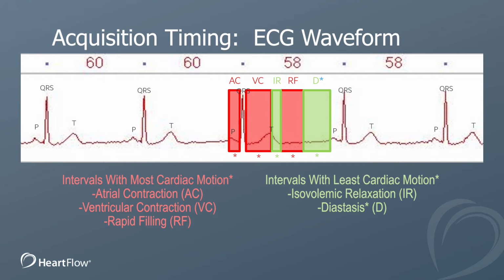If you have a lower temporal resolution scanner, you can see why you need to have a lower heart rate and use beta blocker, based on the width of the rectangle on the right can vary with heart rate. The lower the heart rate is, the wider the green rectangle representing diastasis becomes, and the more opportunity you have to capture a motion-free image of the coronary arteries. So when you give a beta blocker and you expand your TP interval and that diastasis time, you'll be able to capture a motion-free image at a lower heart rate.